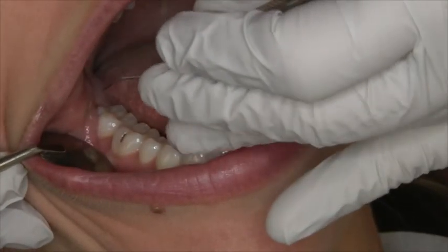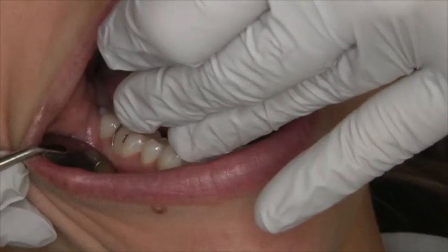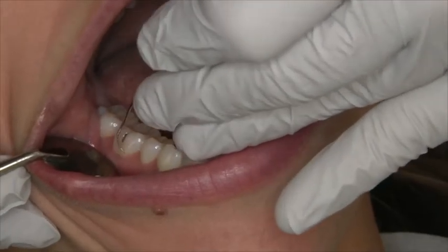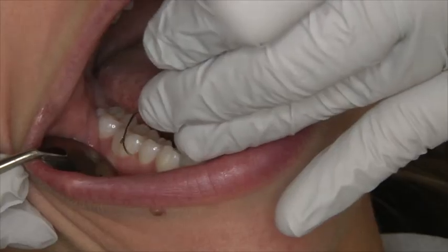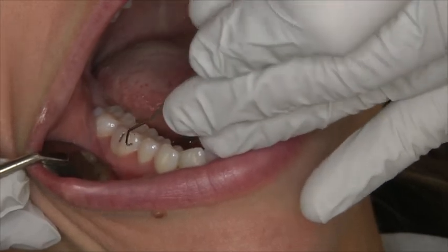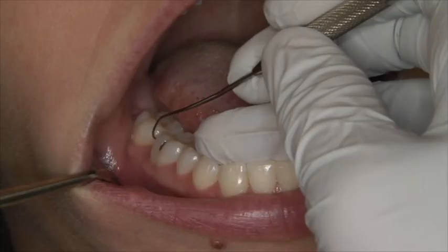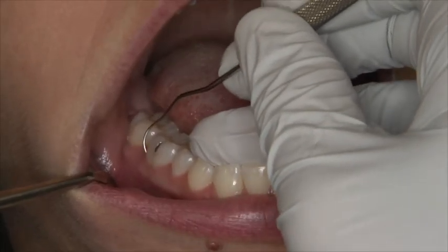Remove the Explorer from the distal proximal surface and readapt the tip at the distal line angle with the tip pointed towards the mesial. Using short, overlapping oblique and vertical strokes, explore between the gingival margin and junctional epithelium mesially. The right-handed clinician should use the instrument using the same principles as the left-handed clinician, but from the other side of the chair.